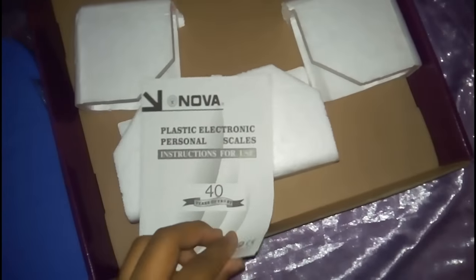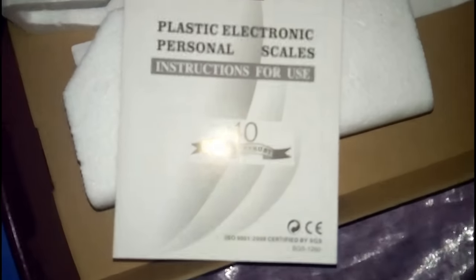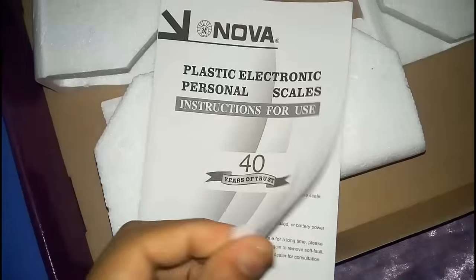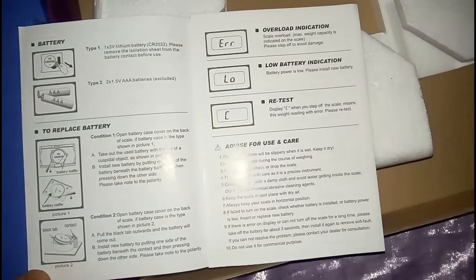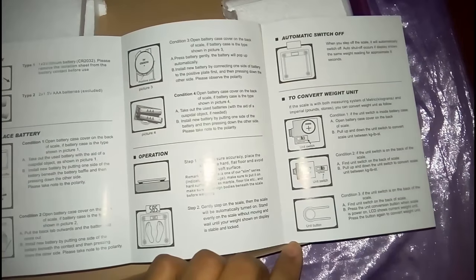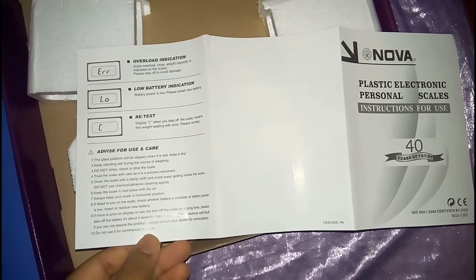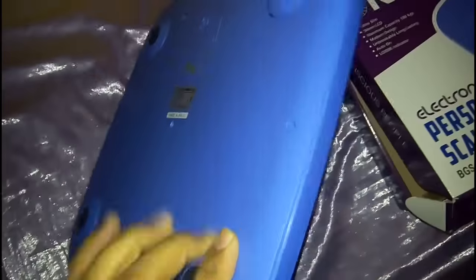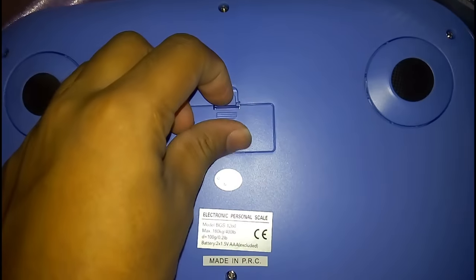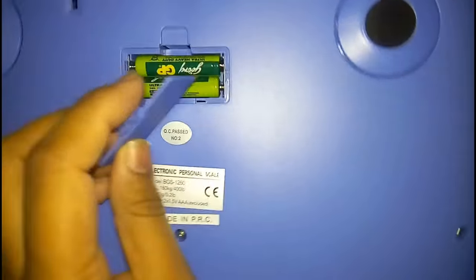I am going to unbox the NOVA. Here is the machine. This is the machine.